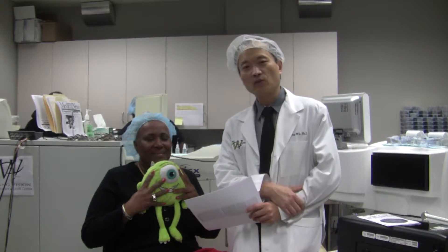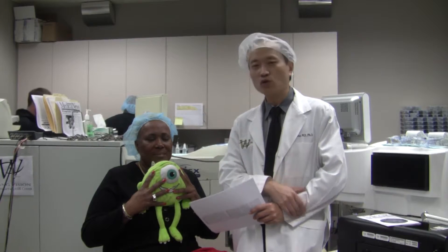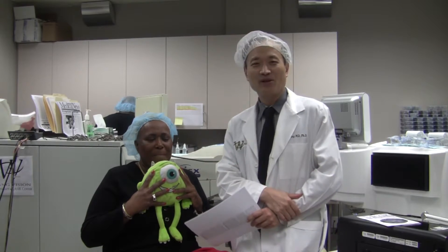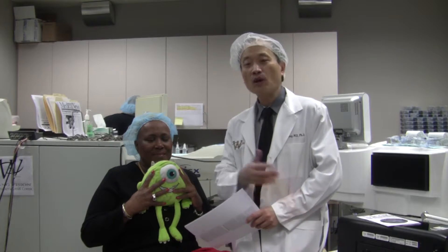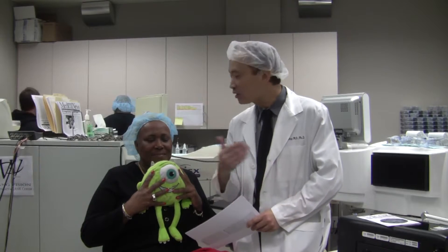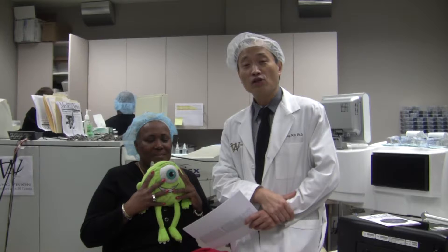Dr. Pickstock had what we call hyperopia and also presbyopia, otherwise called short arm syndrome. As we get older, our arms get a little shorter. I think I can tell the folks on camera — you're old age 40, right? So that's short arm syndrome. Dr. Pickstock does not want to have her arms lengthened. She actually had a CK procedure in the past trying to help with that. So today we just had 3D LASIK to treat her short arm syndrome.